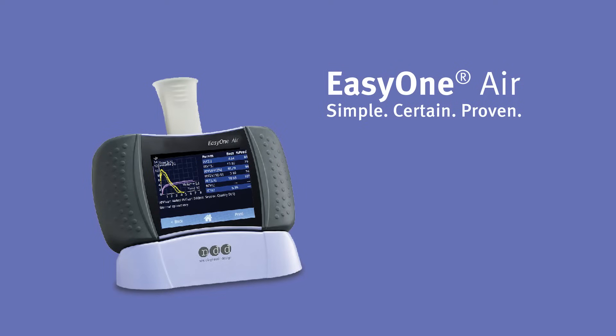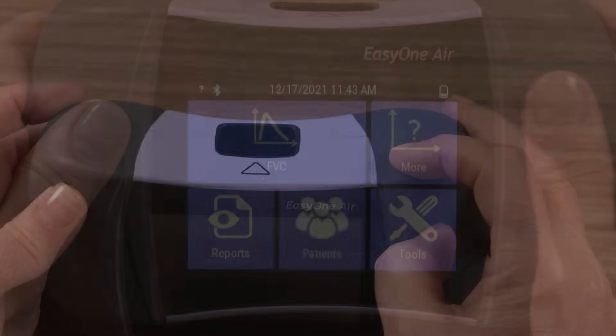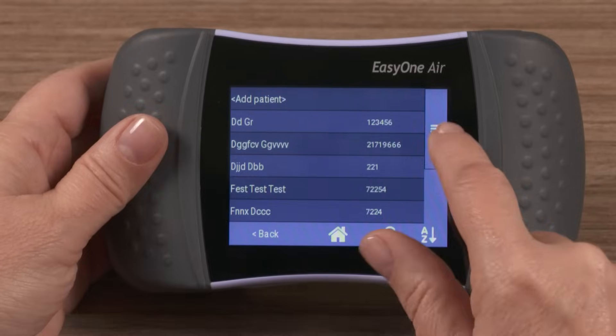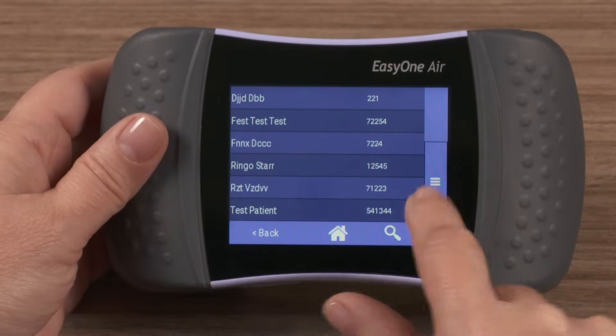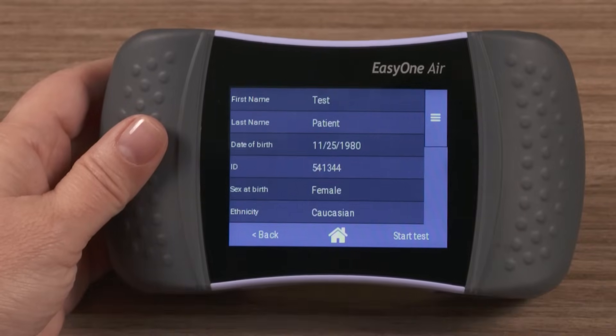To get started with the NDD EasyOne Air device, first we will power on the device, then add or select a patient, confirming that all information is correct.